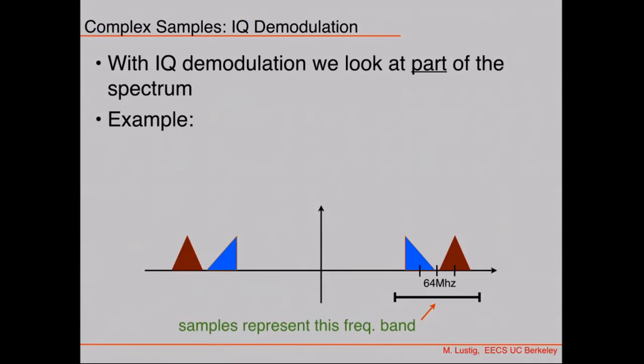So here's a difficult situation. I told you that MR images are complex, right? Complex valued. And you believe me, right? The thing is, there's no such physical thing as complex value. There's nothing physical about complex valued signals. In fact, RF is just real. An electromagnetic field is a real field. It's not complex.